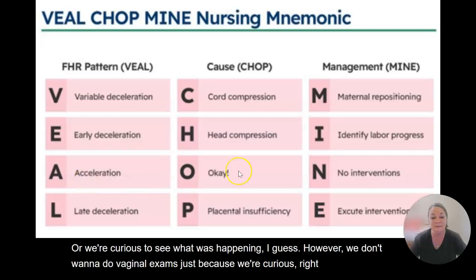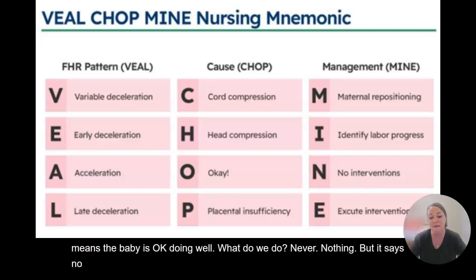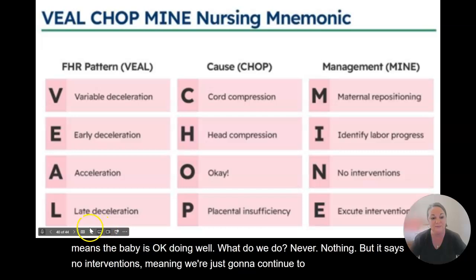A, acceleration. It means the baby's okay. It's doing well. What do we do? Nothing, meaning no interventions. We're just going to continue to monitor the patient.